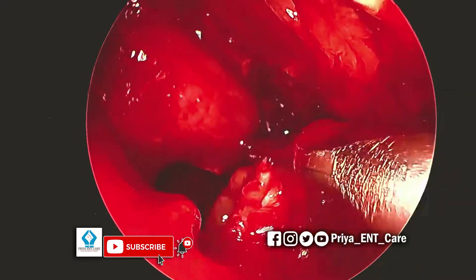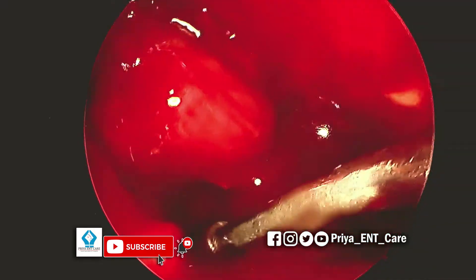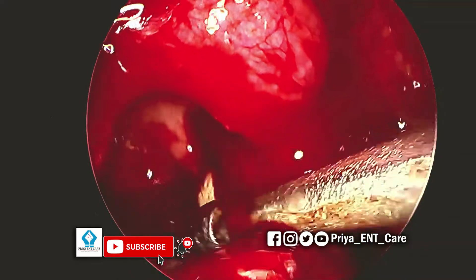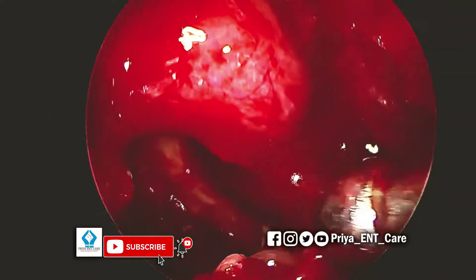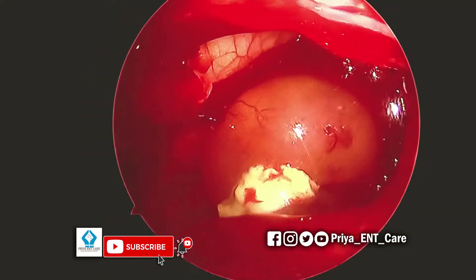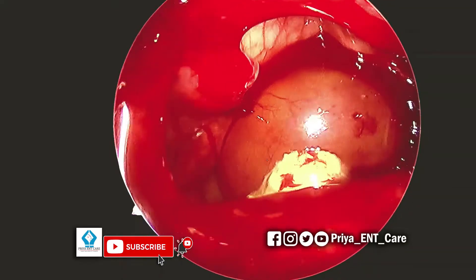Using the microdebrider, the cut tissue is being removed.